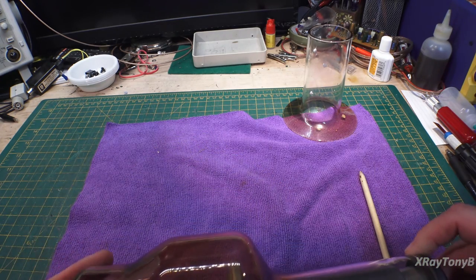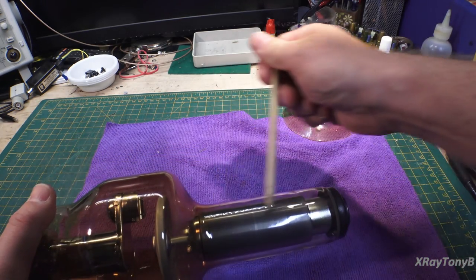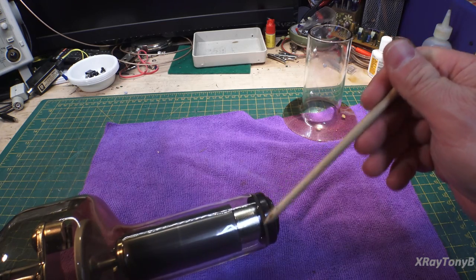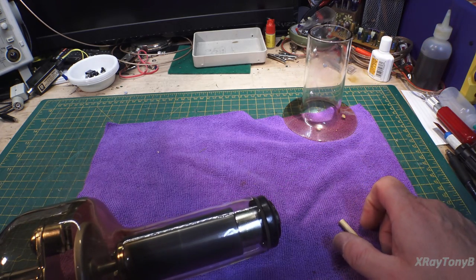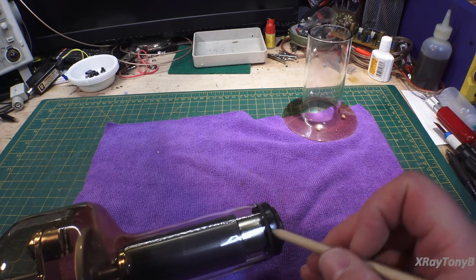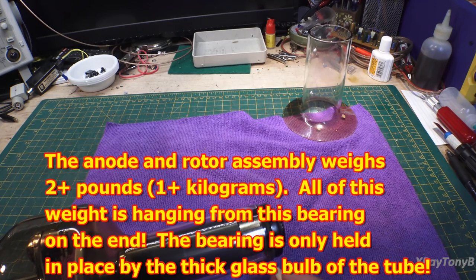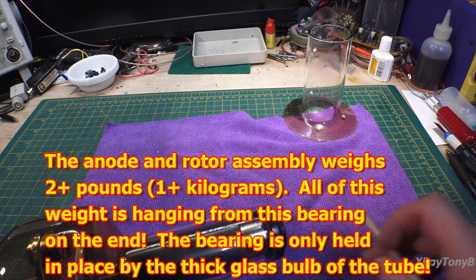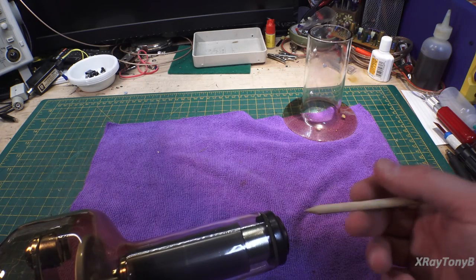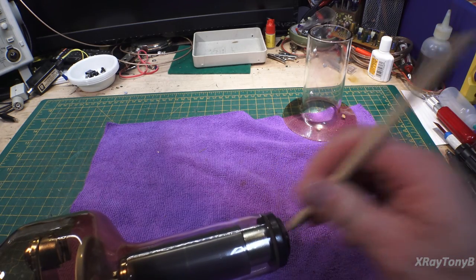So you can also see here that the anode looks kind of funny. It's got this big shaft on it, and at the end of that shaft right here is a bearing. It's a very, very special, very low friction bearing. And in the old days, in the 1980s and early 90s, the lubricant that they used in these bearings, I don't know what it was, but a couple companies had some patented versions that literally, a very small amount, a little small container of it, cost over $200, they said, American, just for a tiny little amount of that lubricant that they use in that bearing.